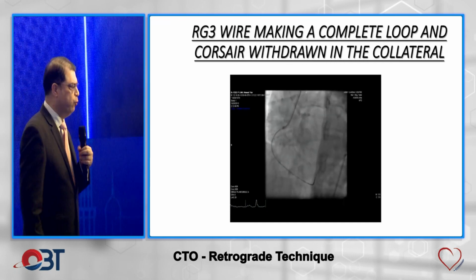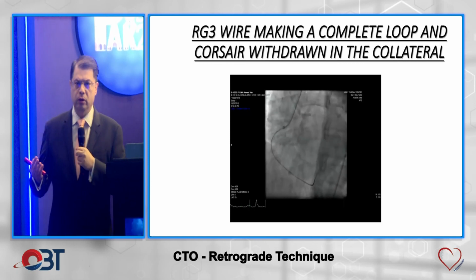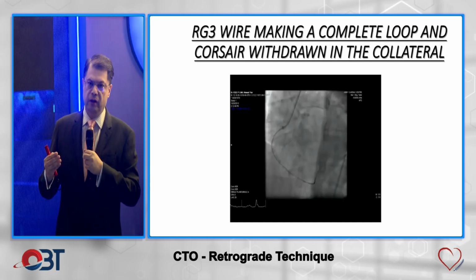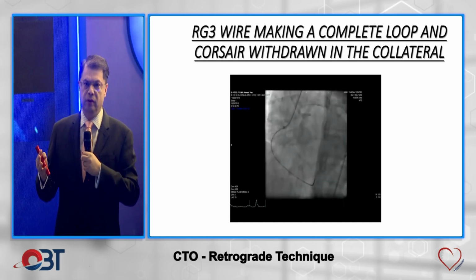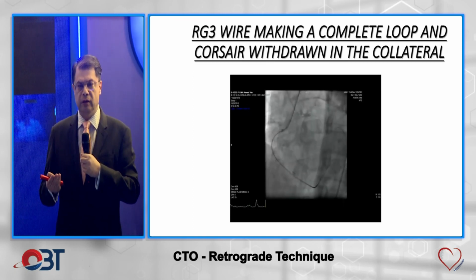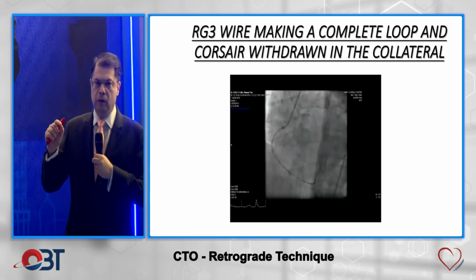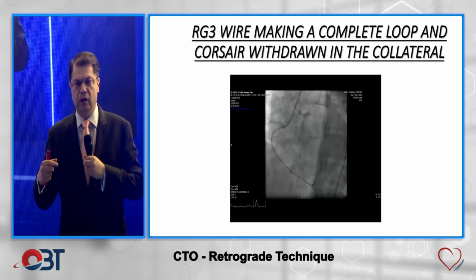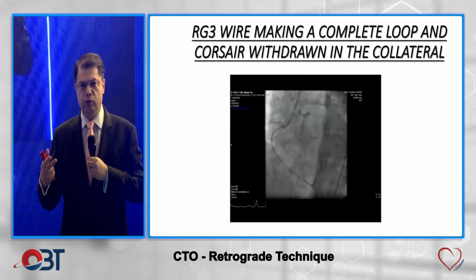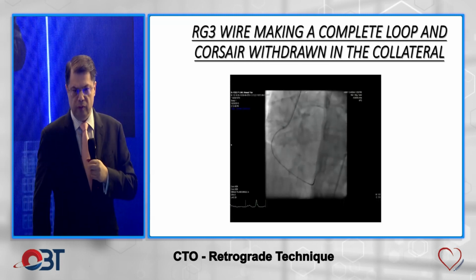So this is very important because you don't have to persist in a failure mode. If you think that you are not succeeding, let's say 10 to 15 minutes in antegrade wiring, and you have good interventional collaterals, or you have some other options, you can change the wires, you can do different things if you are in a failure mode. So I think 15 minutes should be a good enough time. Dr. Salman, you want to say something?